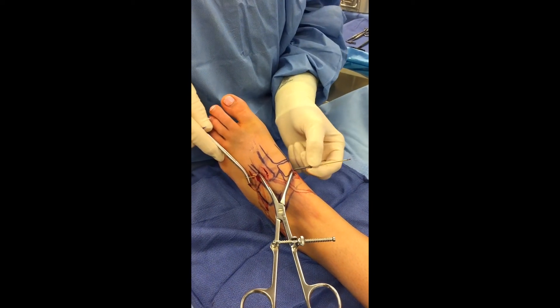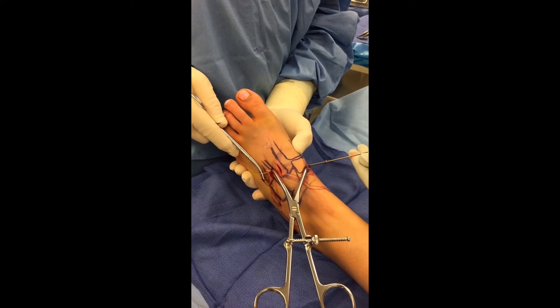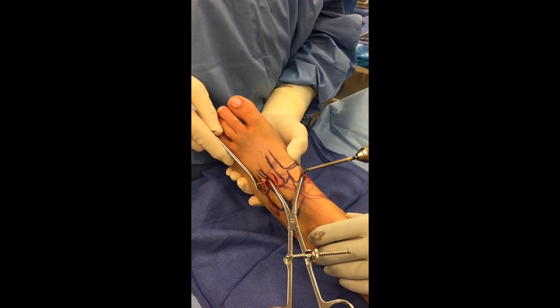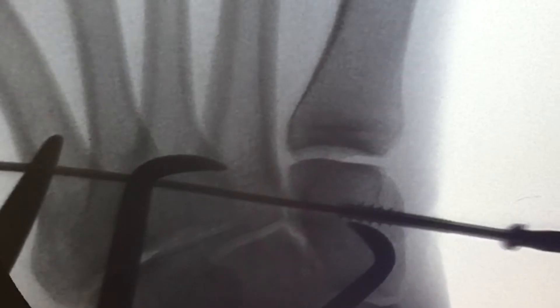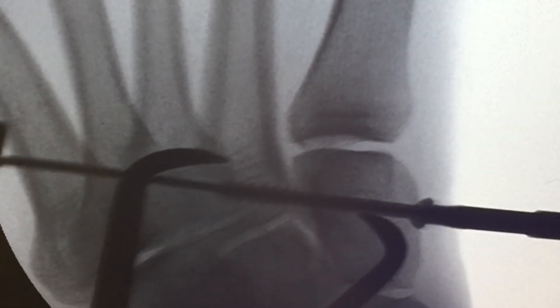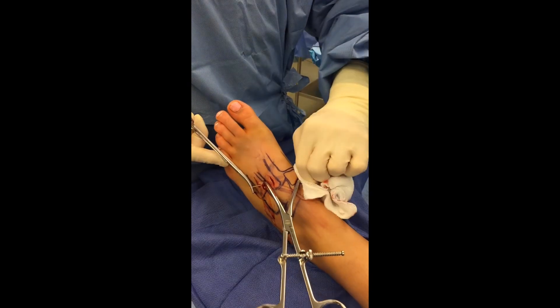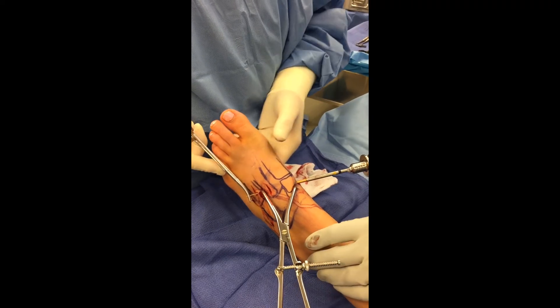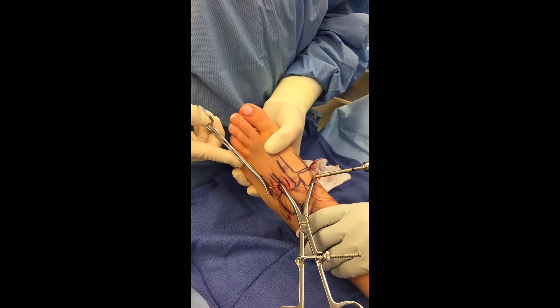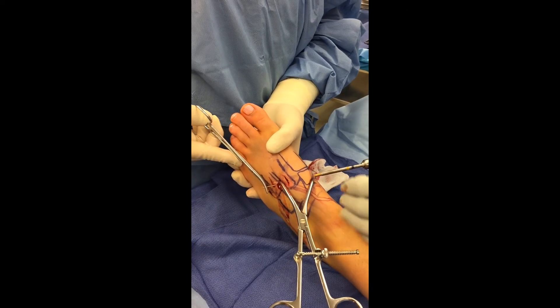A fully or partially threaded cannulated screw is then inserted over the guide pin for this percutaneous procedure and inserted across the Lisfranc articulation. The screw is gently tightened down in position, but the screw should simply be holding the reduction and not creating the reduction. The reduction itself should be obtained utilizing the reduction clamp, and the screw is simply tightened to hold this in position and prevent over-tightening of the Lisfranc construct and mal-reduction of the midfoot.